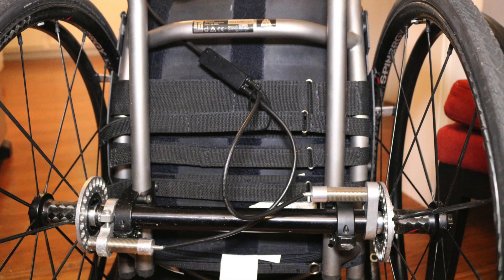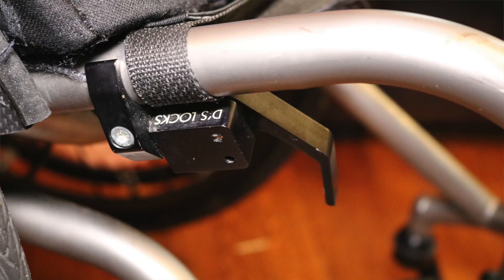The second thing that's really useful, especially when I'm getting in and out of my car, is that one lever on the right side is able to control both brakes on the wheels. Rather than having to reach all the way around when I'm getting in and out of my car to undo both brakes, I'm able to just flip one lever and both brakes are undone at the same time. Super helpful.